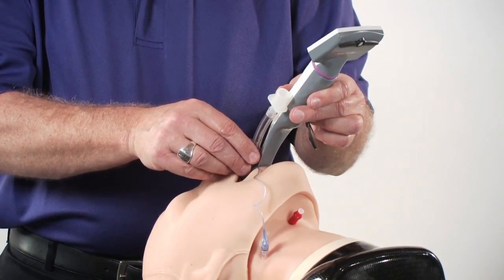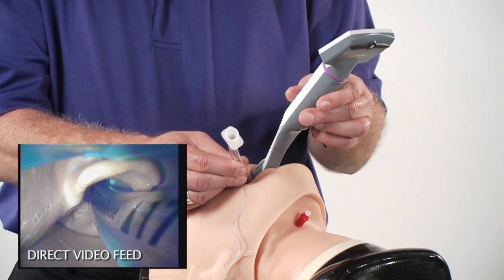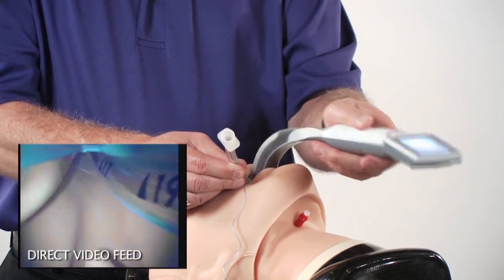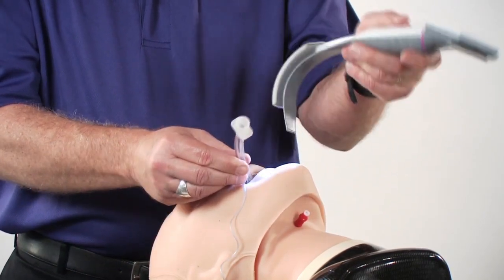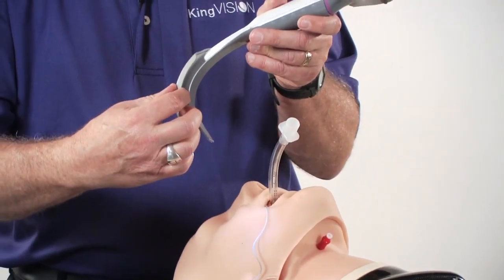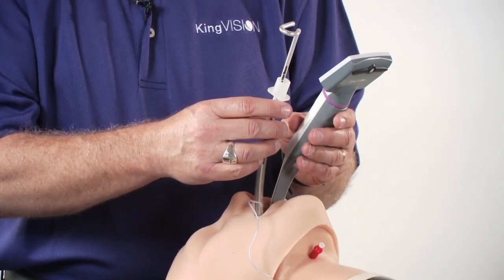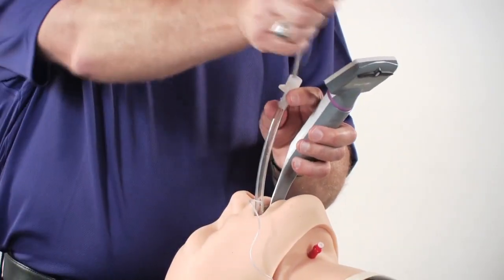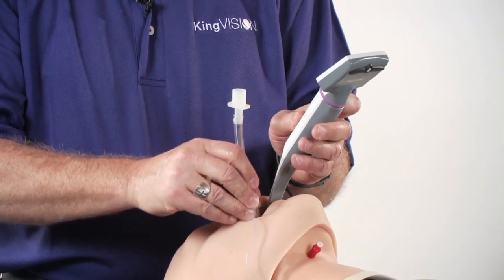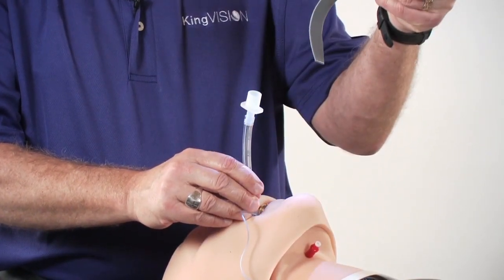To remove the tube from the channel, simply stabilize the tube off to the side to the right as you withdraw the blade from the mouth. The soft, flexible overmold prevents any catching of the tube as you're separating it from the track. With the standard blade, it's important to remove the stylet entirely, make sure the tube is advanced appropriately into position, and then simply remove the blade from the mouth.